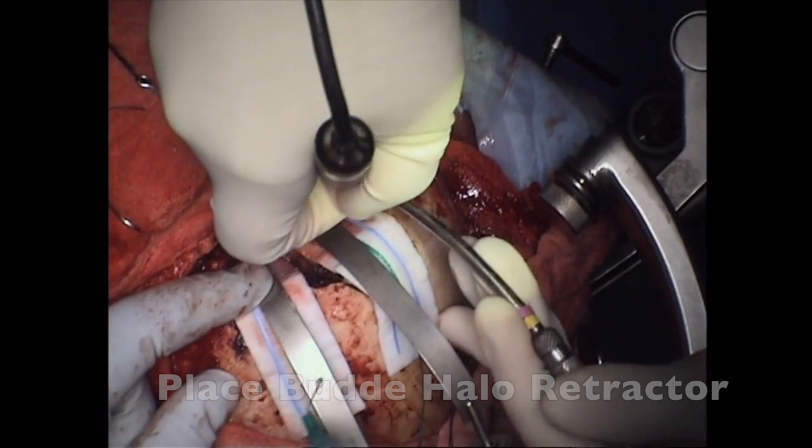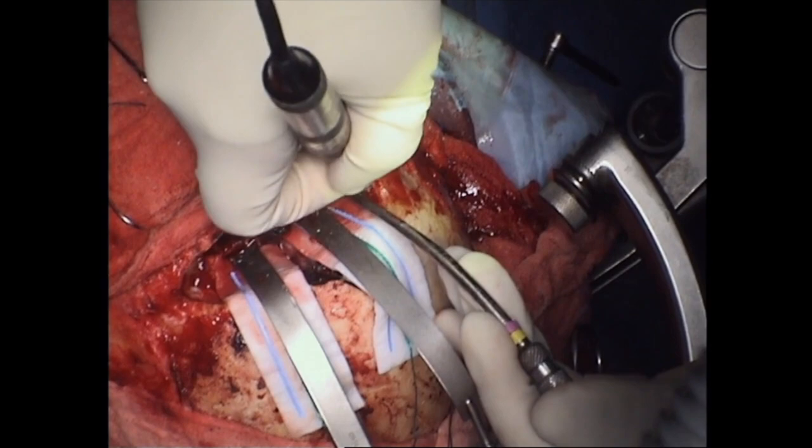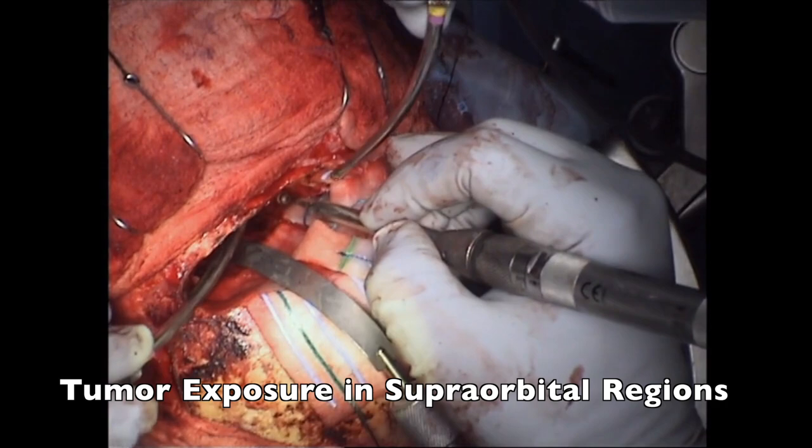In this particular case, we will end up cranializing the patient's frontal sinus. As we work through this area and address and remove the posterior table of the frontal sinus, we will of course remove this area for disease control and tumor resection.